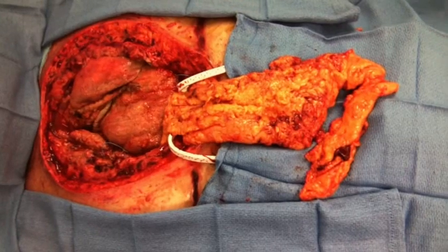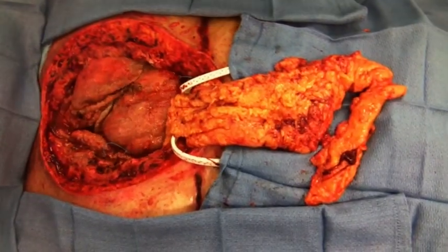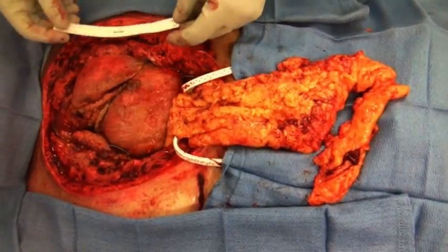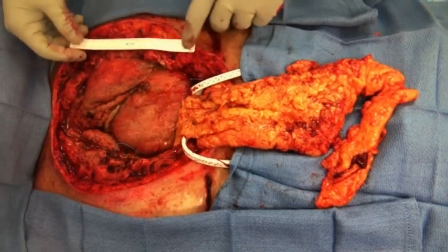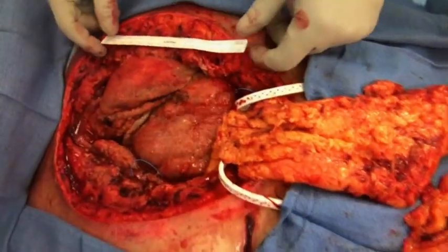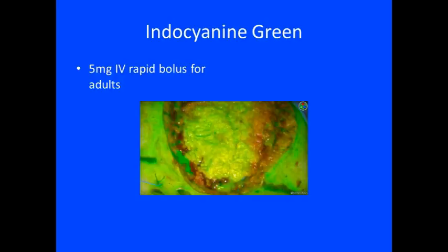Prior to fixation, we can see the sternal defect with the completion of the omental flap in view. A 5mg bolus of indocyanine green was then given to visualize good flap vascularity.